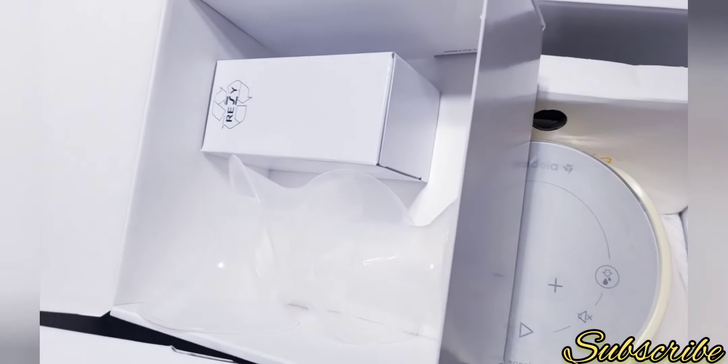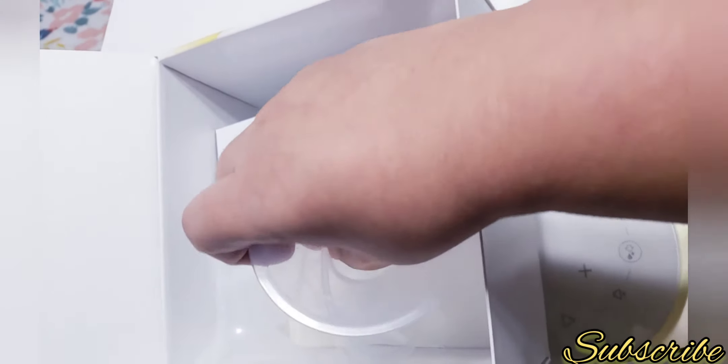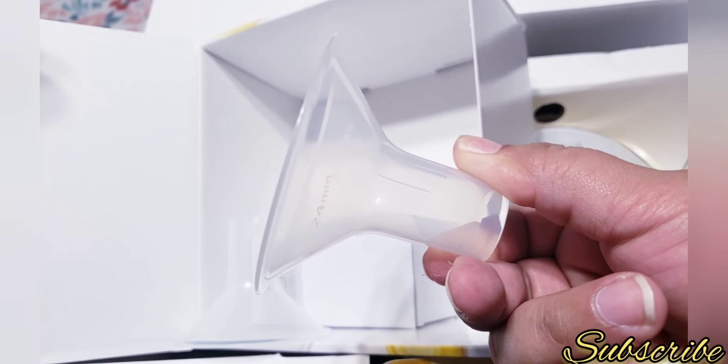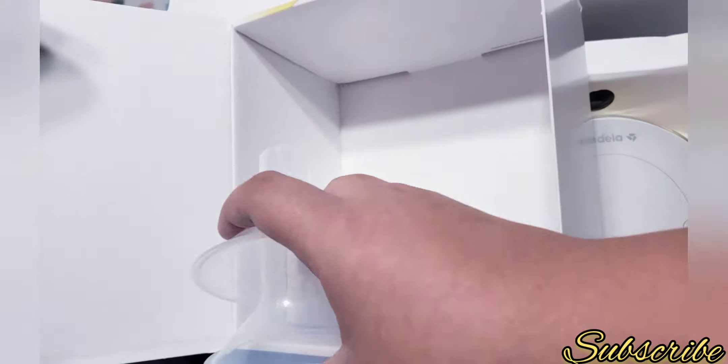It also comes with two sizes of flanges. These ones are the bigger size — 27mm. And it comes with a smaller size — these ones are 24mm. So it comes with both sizes.